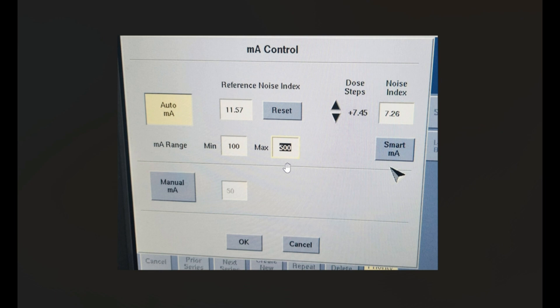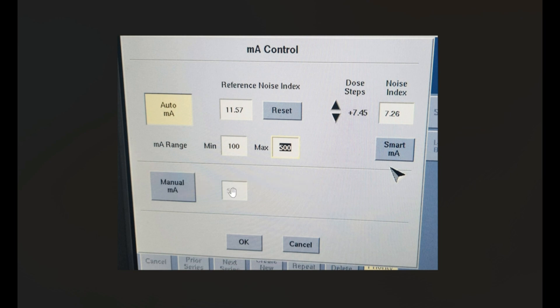You do want to pay attention to the MA given to the patient and the resultant CTDI during dose reviews to make sure you're not maxing out the MA on every single patient. One thing we see quite frequently is that Auto-MA is being used but every patient gets the maximum dose — so keep an eye on that when setting your protocols. If you ever need to flip over to manual MA, you can turn it on and enter the MA value you want to apply, which will turn off both Auto-MA and Smart-MA.